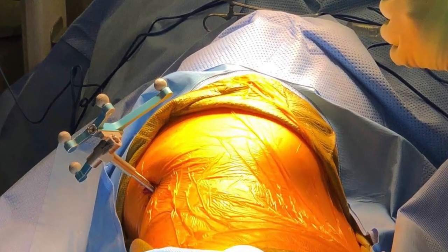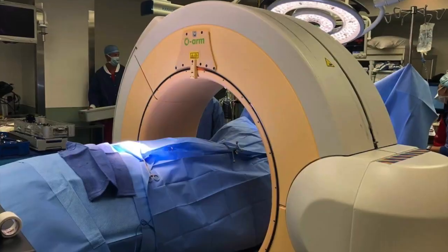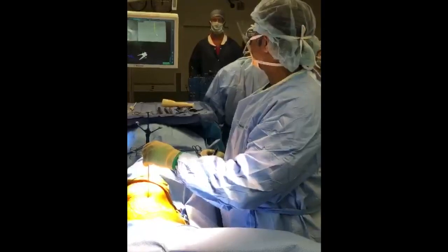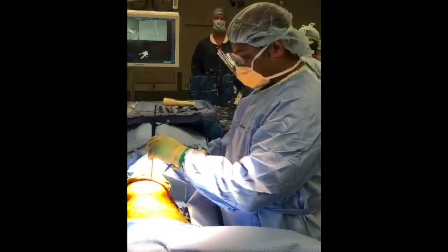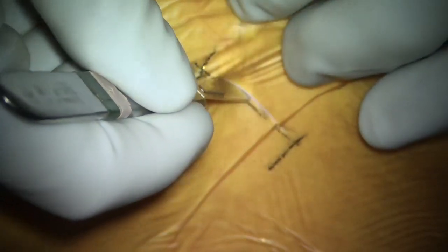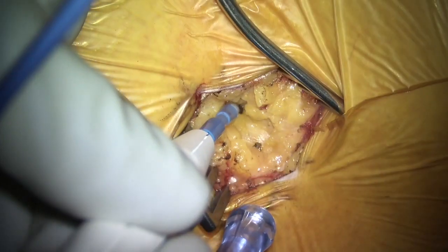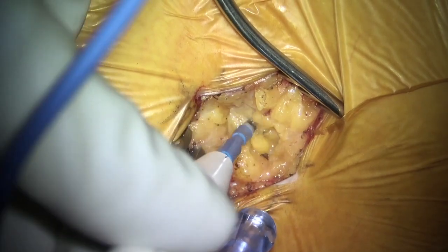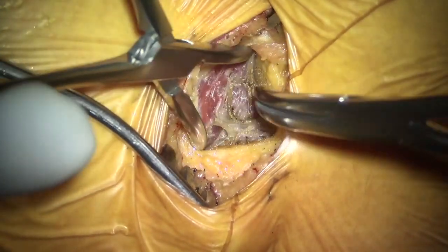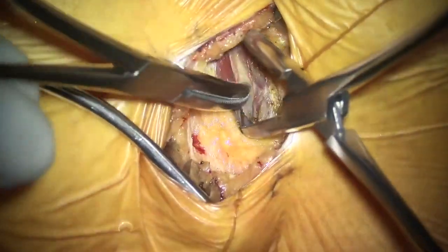The patient is made to lie in the lateral position, as you can see in the images. The posterior iliac crest is marked and the navigation probe is attached. You bring in the O-arm and get your scans in AP and lateral views, and then mark the incision site.